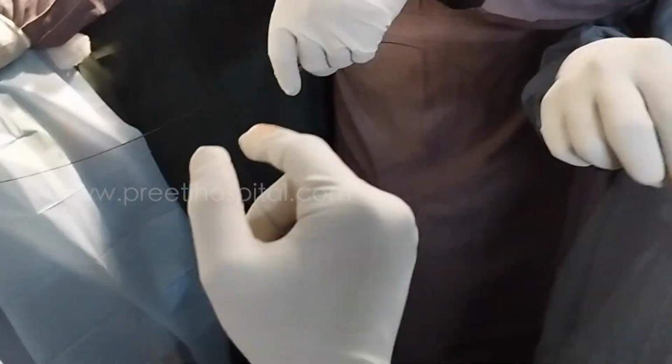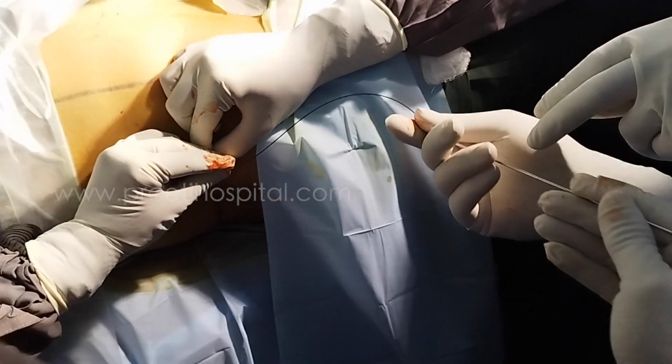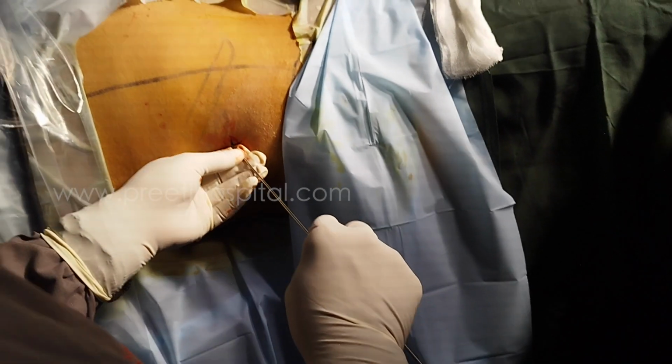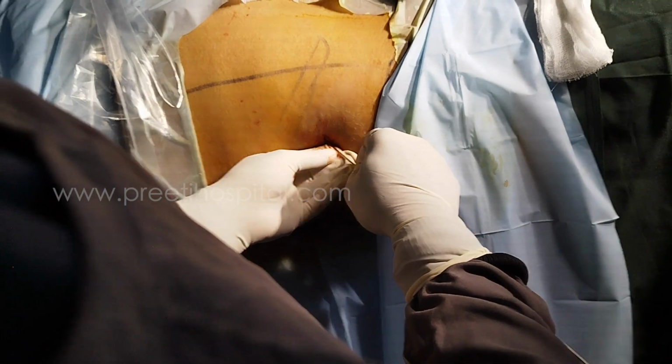But in a thick, muscular patient you have to do it. This is my favorite thing: rectus sheath dilatation. Now I will put the central rod. Whatever the dilation, 18, you put the dilatation. See, slowly I am going. Whenever you do this, before entering the kidney, slowly it entered now.